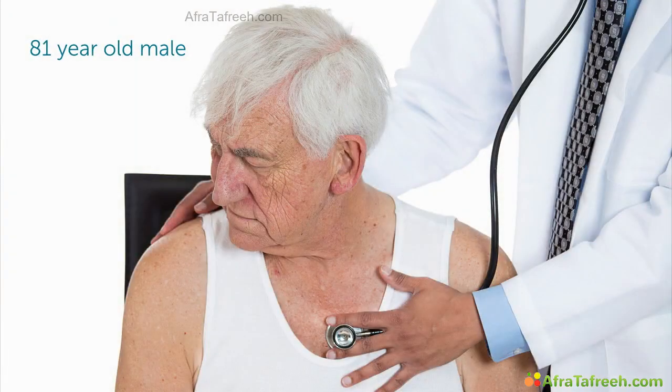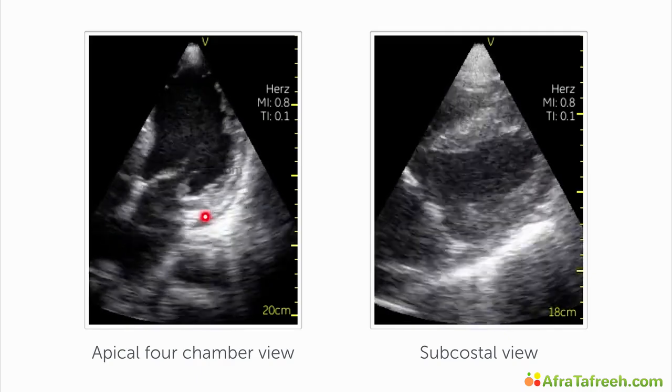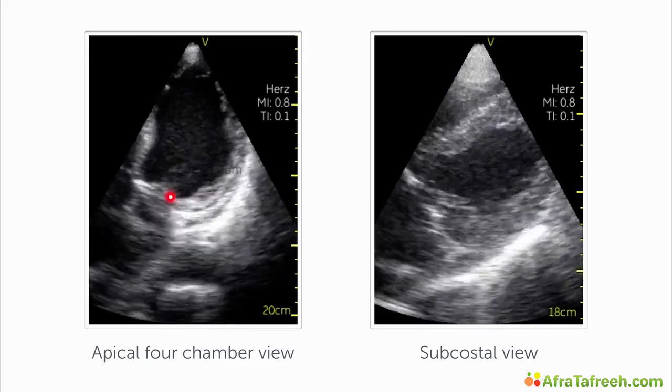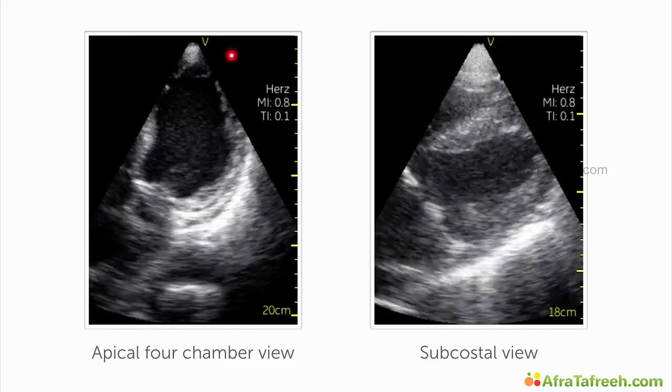This is an 81-year-old patient who comes to your office with a long-standing history of hypertensive heart disease. He comes because he has dyspnea, and these are his images. Here we have the 4-chamber view, and as you immediately can recognize, global left ventricular function is significantly reduced. Note that the ventricle is also dilated, and note that the myocardium is rather thick.